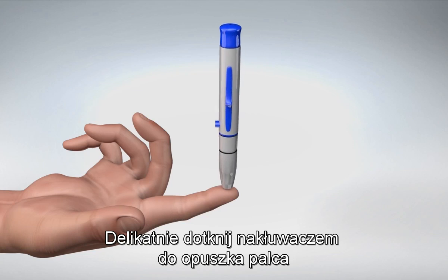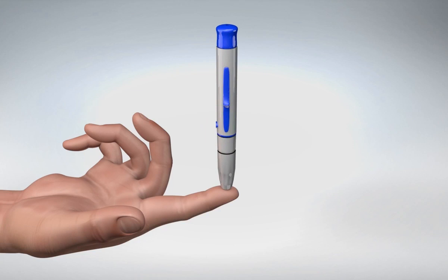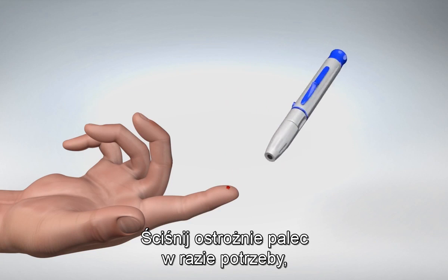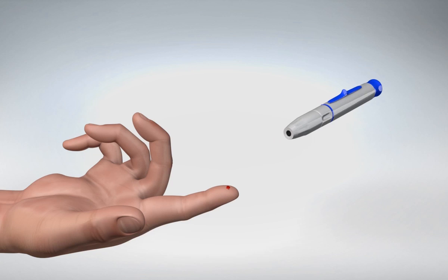Gently touch the lancing device against the side of your fingertip and press on the release button. Squeeze your finger gently, if needed, until a blood drop the size of a pinhead forms.